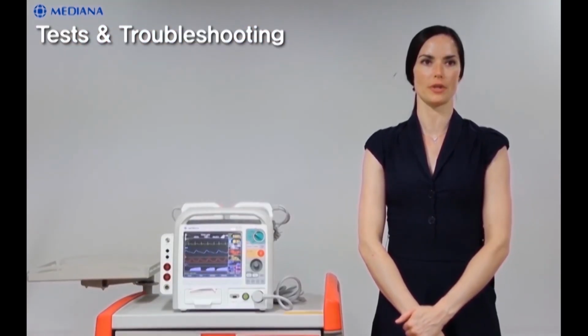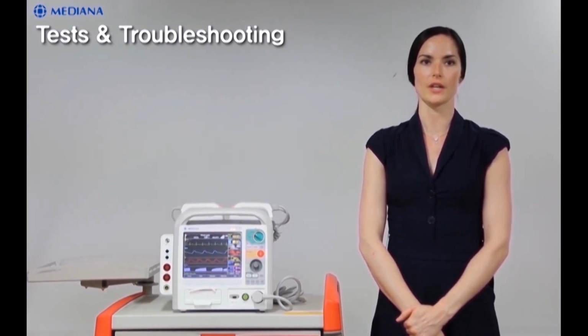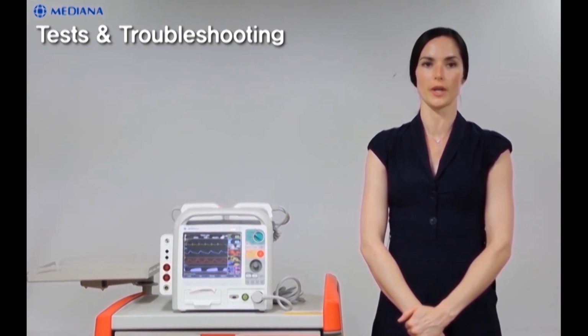Next is troubleshooting. After finishing the auto self-test, the D500 will be turning off itself. If there was no fail, the service LED will be blinking. But if any fail was detected, the service LED will be fixed and a buzzer sound will be generated.